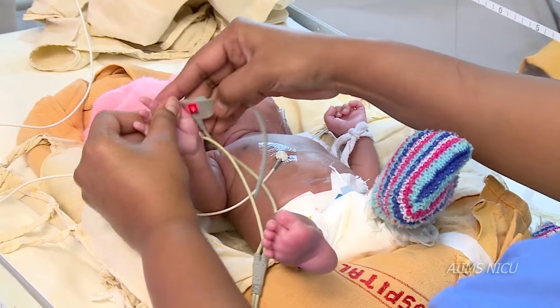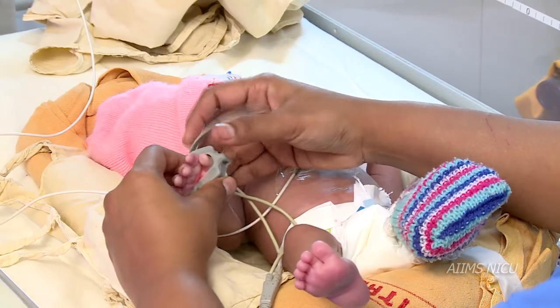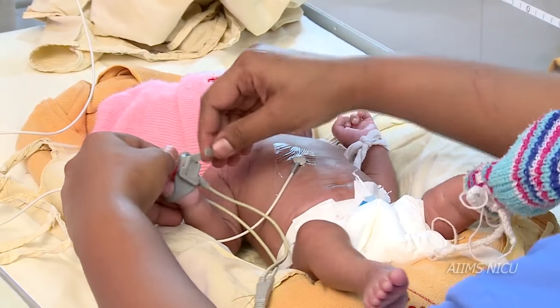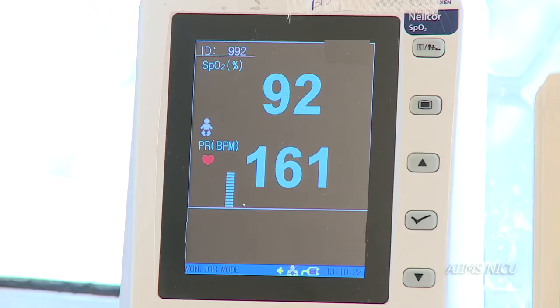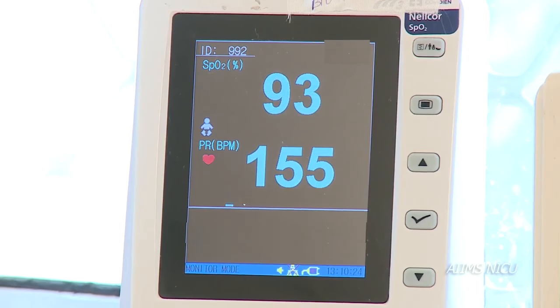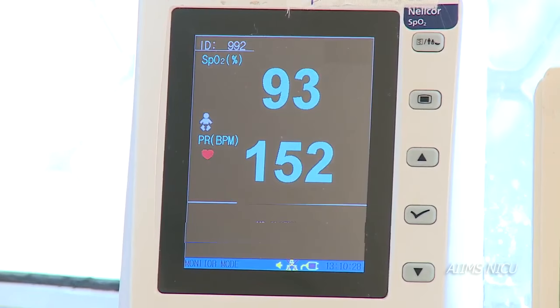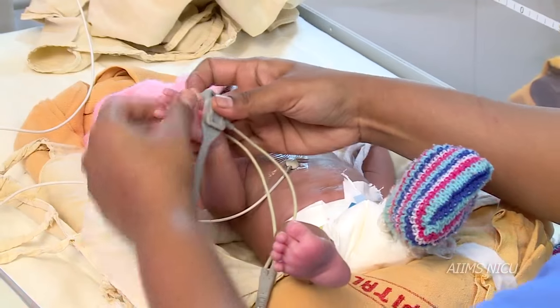Ideally, a pulse oximeter should be used for all newborns receiving oxygen therapy. The target oxygen saturation should be between 90 to 95 percent. Attach the pulse oximeter saturation probe to the newborn's foot or palm.